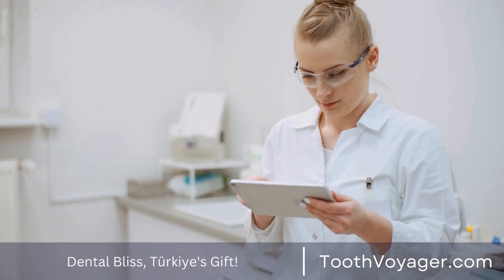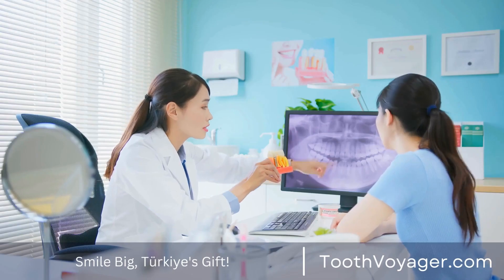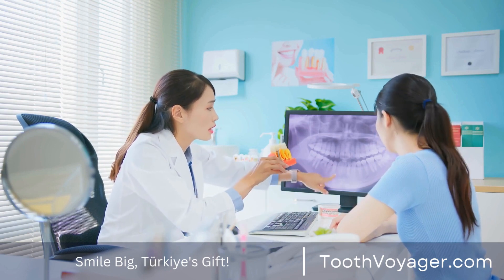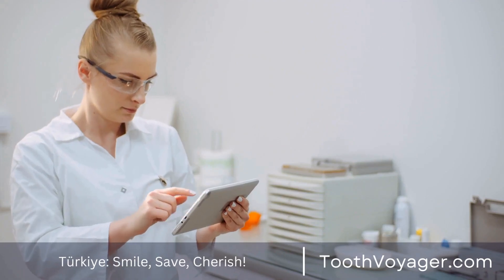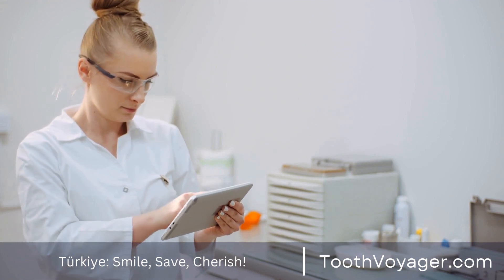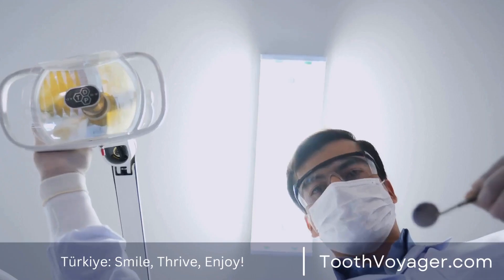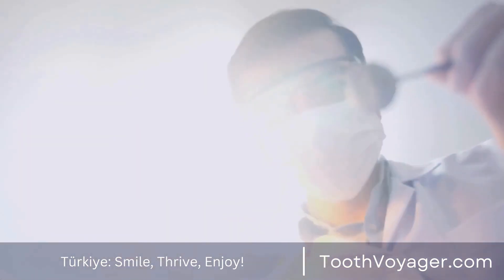The procedure for getting a dental bridge usually requires numerous visits to the dental office over the span of several weeks. First, the visit involves preparation of the natural teeth that will support the bridge by shaping them to ensure the crowns will sit over the teeth. The dentist will also take impressions of your teeth and create a mold of the bridge.